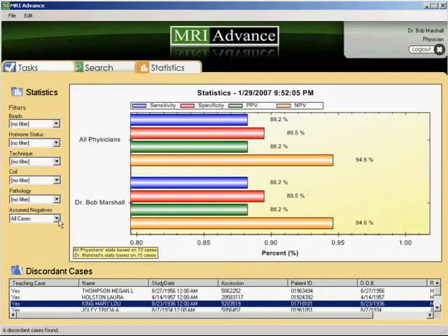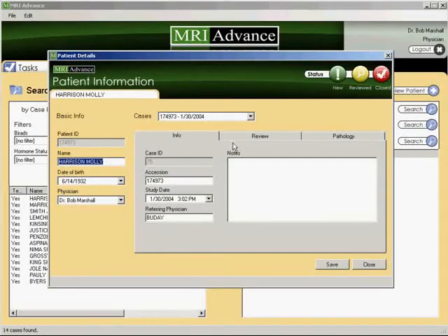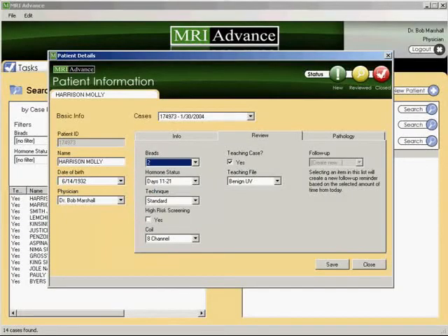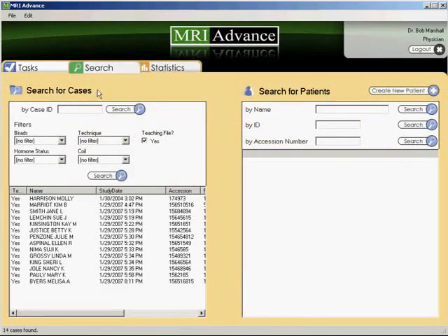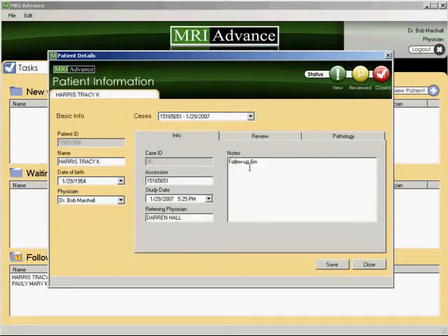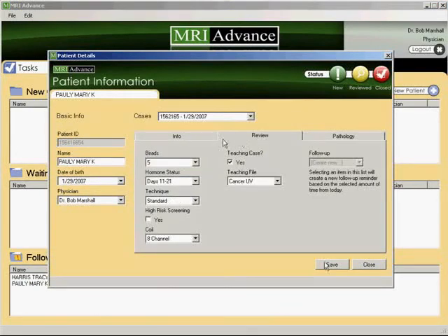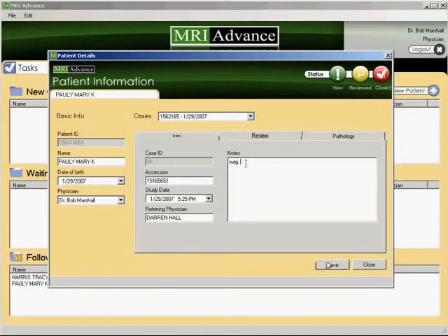This allows you and your partners to review discordant cases and hopefully learn from them. The fourth component of the software is the patient follow-up section. This section is most commonly accessed by your secretarial staff, and notes what follow-up is due on a given date. Patients with a BI-RADS 1, 2, or 3 will appear in the follow-up menu 13 months following the date of their exam, reminding staff to follow up on the patient's mammograms or any other activity which may indicate unsuspected breast pathology. Patients with a previous BI-RADS 4 or 5 will be flagged with a surgical pathology reminder one month following the exam. Any specific follow-up designated at the time of interpretation will also appear in this section.